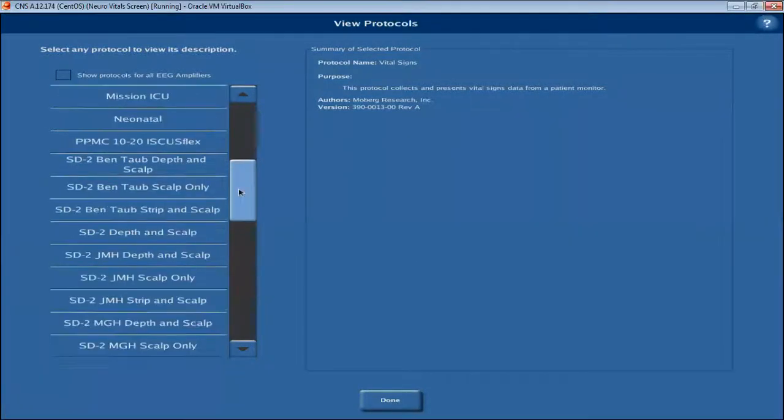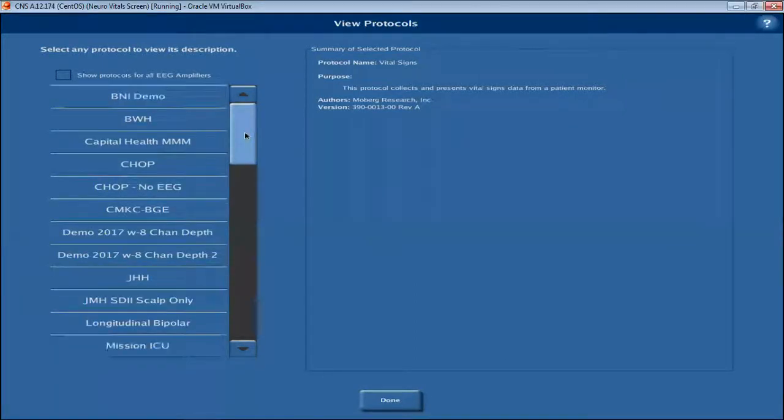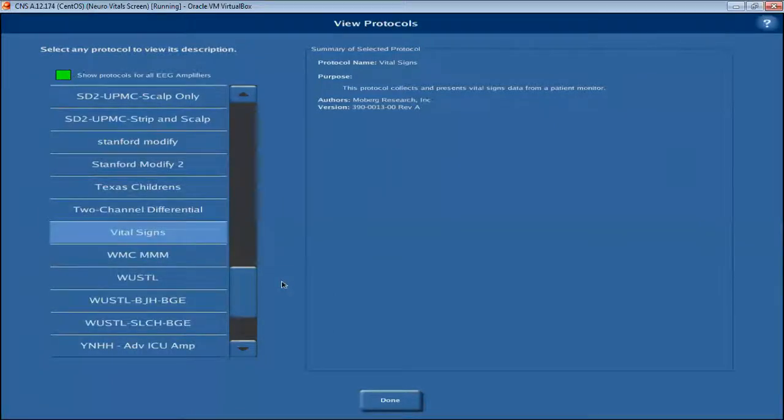I wonder why we don't have those in ours, Kathy. That's probably on my other monitor. You're the bicentral biparietal. It may be the amplifier. I don't know if you have, yeah, because it uses the other amplifier. Right. Let's try that. Good thought.